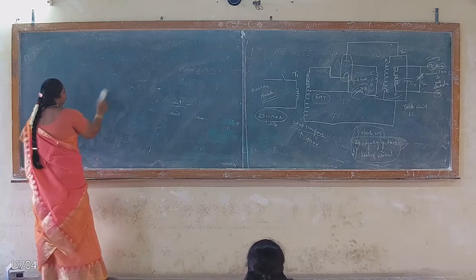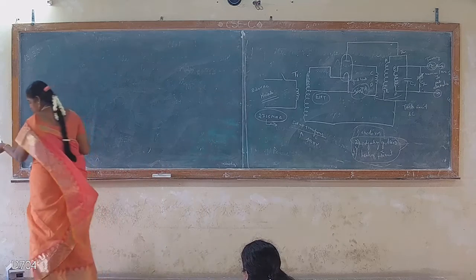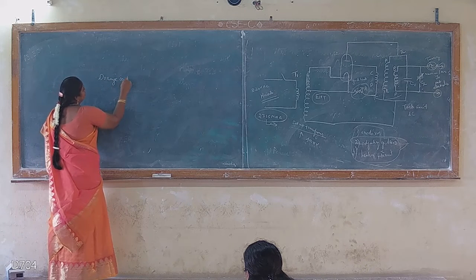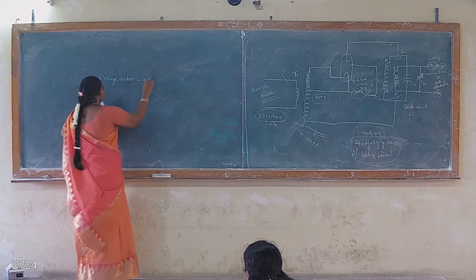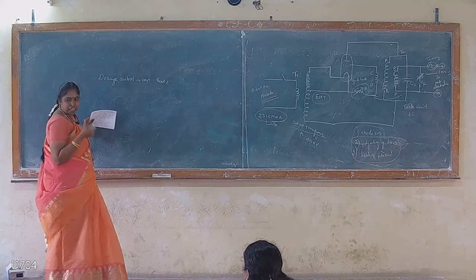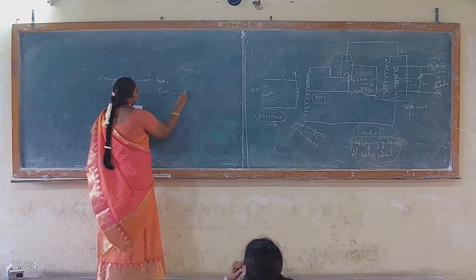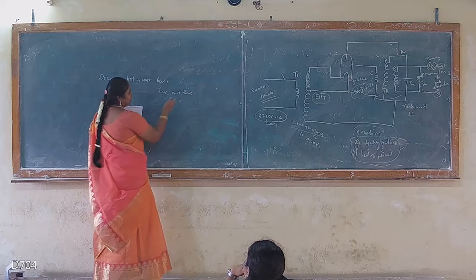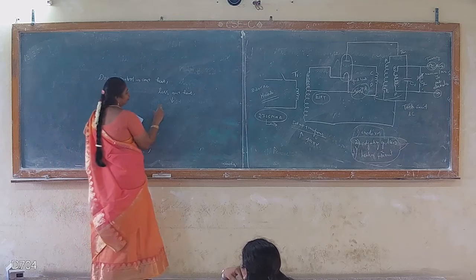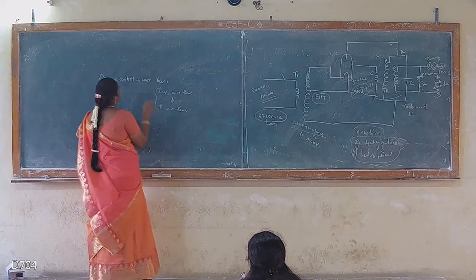Before that, the tuning is very essential, because tuning gives dosage control. Dosage control is nothing but the amount of heat. When we are at the beginning of the treatment stage, maybe a smaller amount of heat is required. Once we start to apply it, the patient may be able to withstand some amount of heat, so we can increase the amount of heat later. This is what is called the dosage.